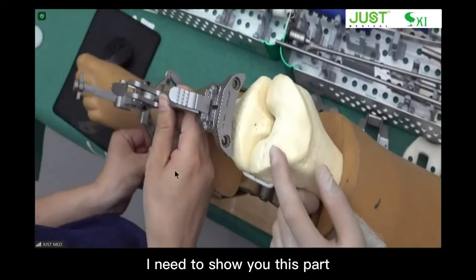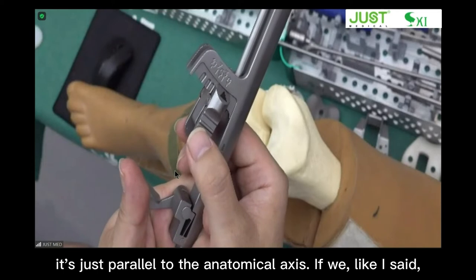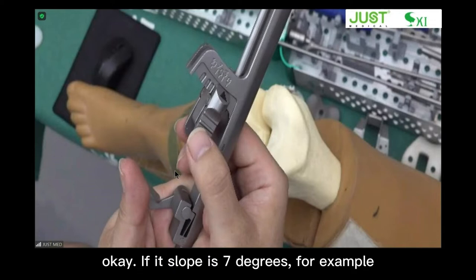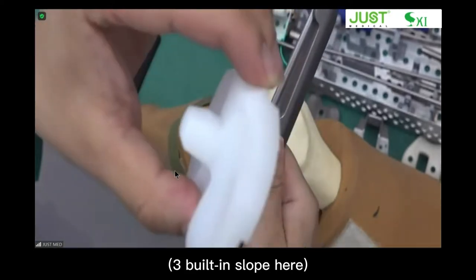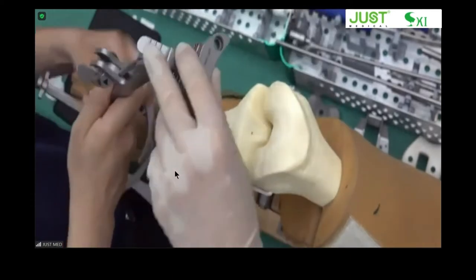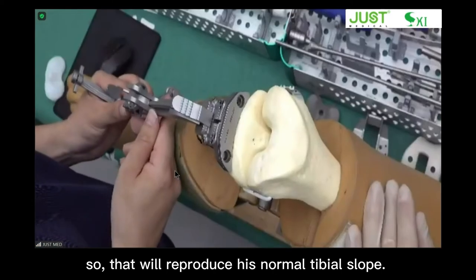I'll show you this mark. If it's zero, it means it's parallel to the anatomical axis. Like I said, if this patient's slope is 3 degrees, you just choose zero. If his slope is 7 degrees, for example, we need to choose 4, because 4 plus the 3 built-in slope here will sum to 7 degrees. So that will reproduce his normal tibial slope.